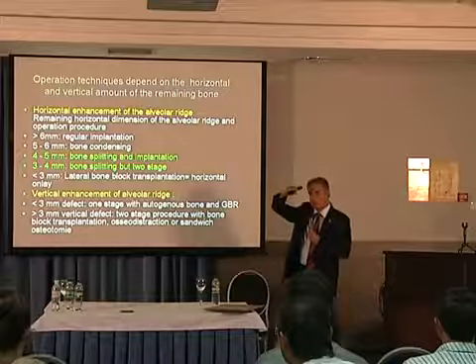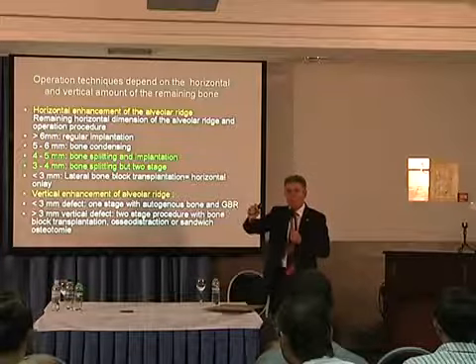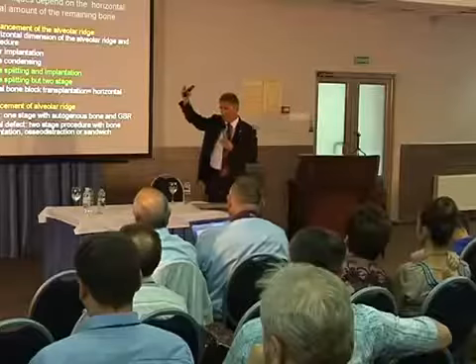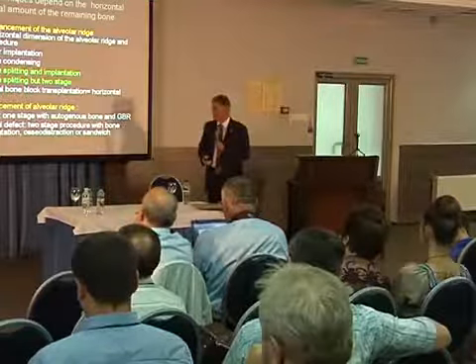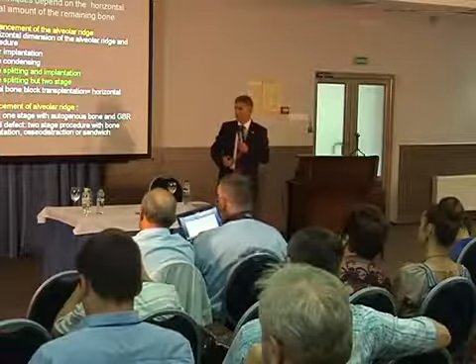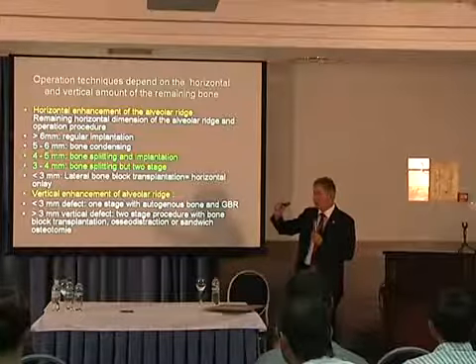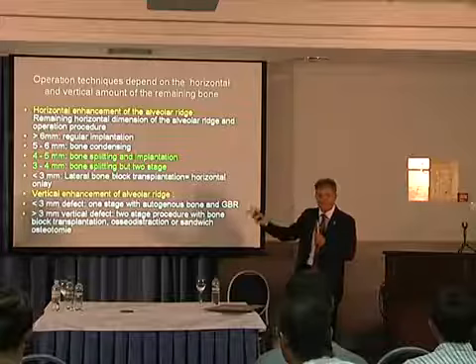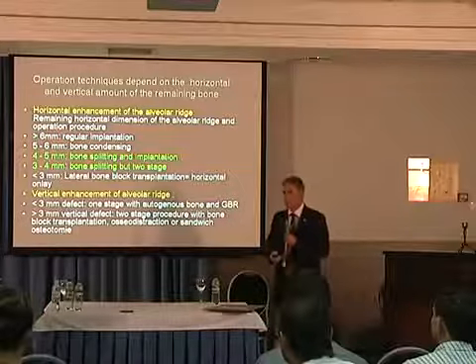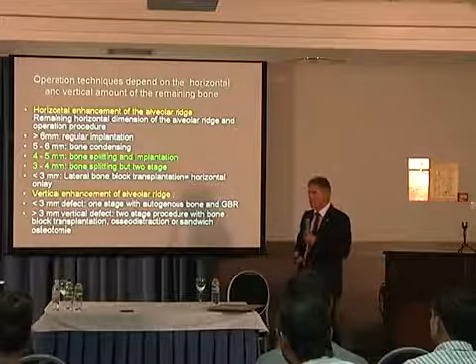More than 3 mm vertical defect, we speak about aesthetic long-term outcome, when your implant restoration should really look like a healthy natural tooth. And not a double or 3 times crown length. When we have more than 3 mm, we think about the aesthetic function of the implant, so that we can hide what we need under the mucosa and get a positive result. Not 30% white ceramic and 70% pink ceramic. And of course, when doing such implantation, we must clearly remember the proportional ratio of root and crown, not having a very small root and a very large superstructure.